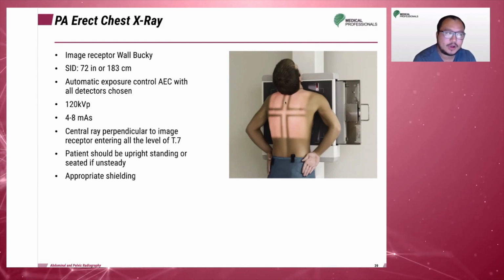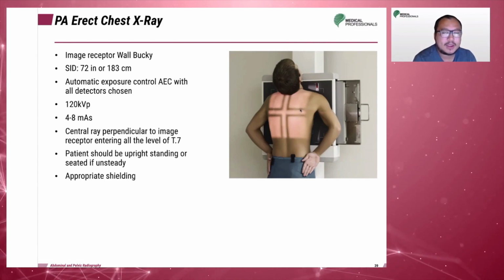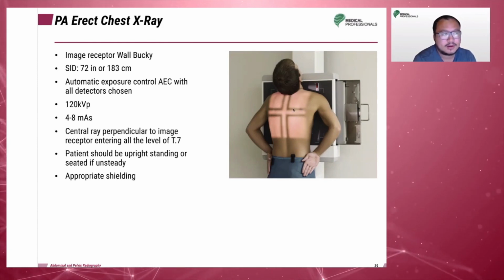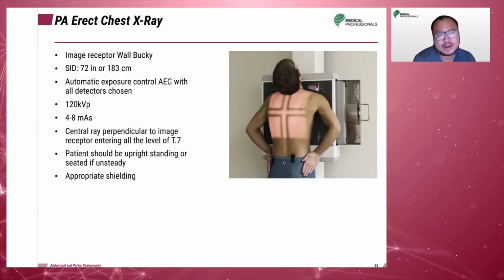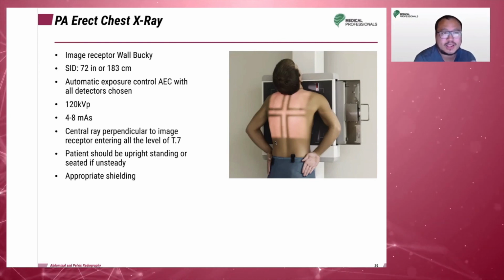So we can use that as our vertical crosshair. The inferior angle of the scapula can be utilized as a T7 cross-reference point, okay? So that's what we can use. And then we want to place shielding to our patients. Since we're not really anywhere near close to the gonadal area, we can potentially shield that area without being wary of getting the shield in our image.